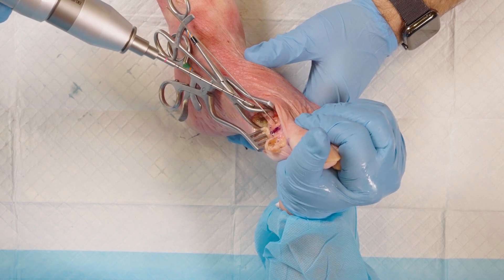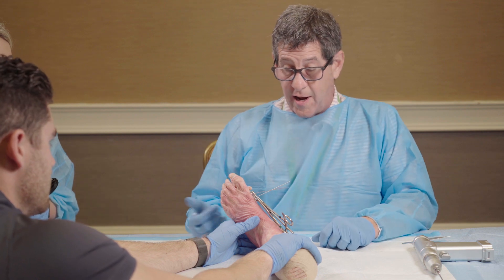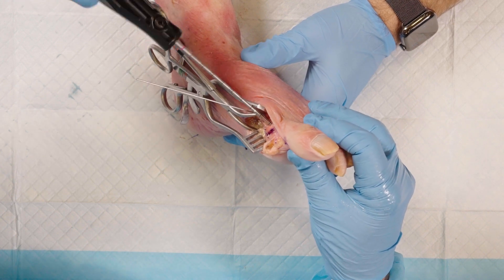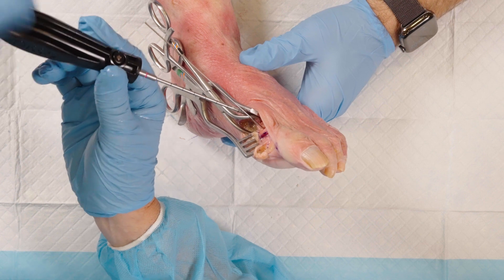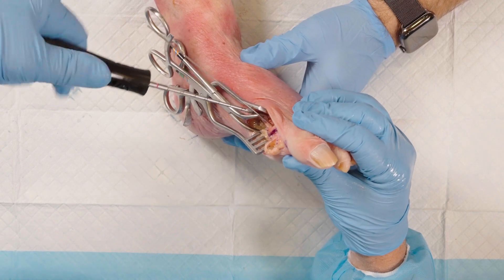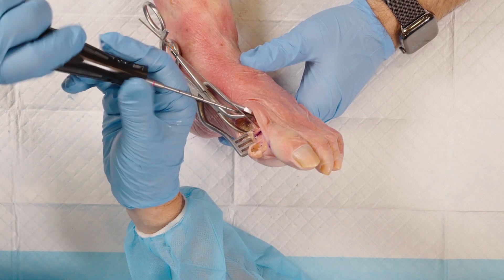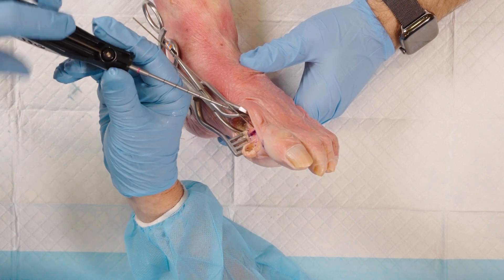Doing the same thing here — keep that drill moving. Now I need to tap. With these implants it's important to tap. Following my laser lines, I'm going to need to tap down to the 18. Now I'm at 10 and doing the same thing. We need to make sure that we pass the cortex on this one, since it's a bicortical screw — we have to be sure that we get past the distal cortex so that we get full engagement and the compression that we desire. I went a little past 18 just to be sure, and we're in the first interspace. There's nothing to be worried about if we go a little bit too long there.